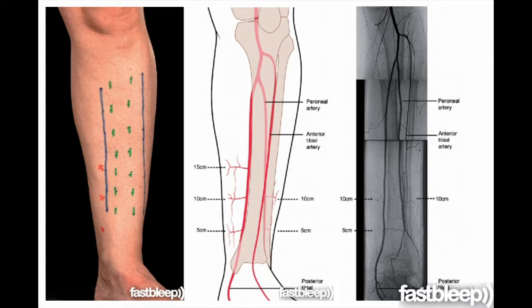This short video aims to explain how to monitor compartment pressures using arterial line monitoring equipment and an anaesthetic machine. Compartment syndrome is usually a clinical diagnosis, and in certain cases no investigations are required and the patient can proceed to theatre for immediate fasciotomy. In uncertain cases or with an obtunded patient, you may need to monitor compartment pressures.